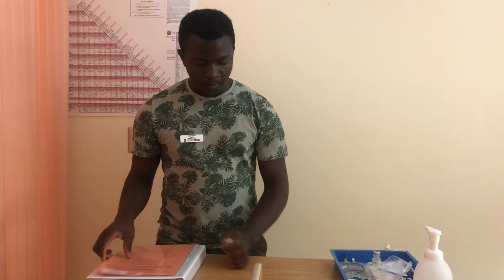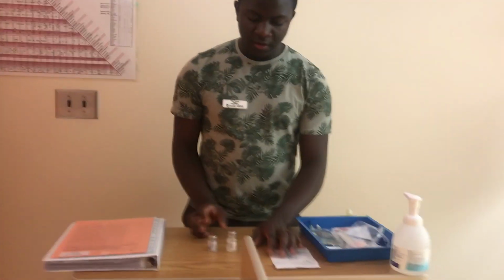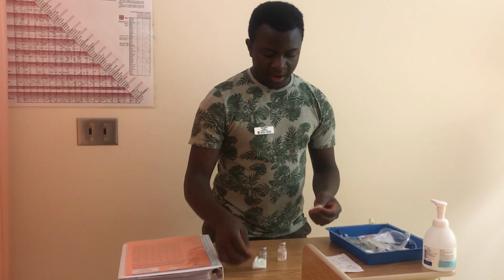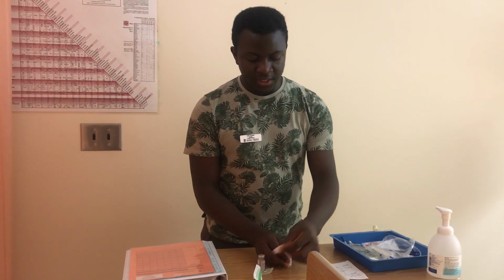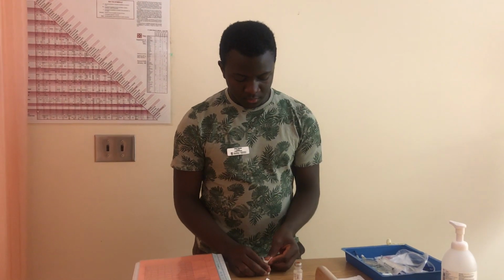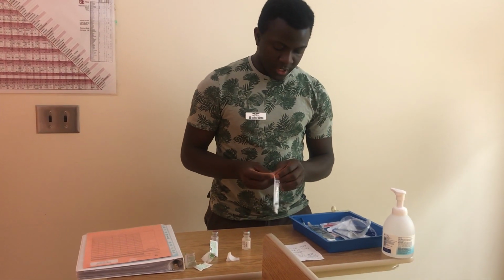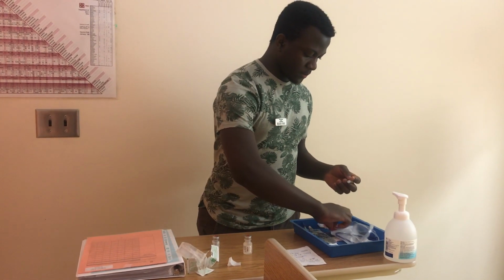I will do this for 30 seconds. I have checked my monograph, and this medication needs to be reconstituted with sterile water. So I will be cleaning my vials. I'll clean both of my vials for 30 seconds and let them dry for 15 seconds. While they dry, I'll prepare my syringe, making sure I'm not touching the end, to maintain sterile technique.